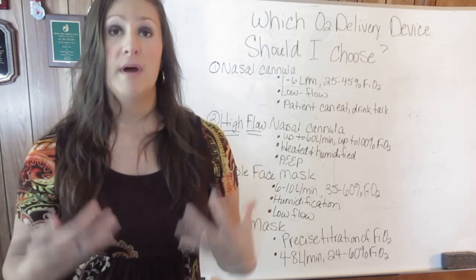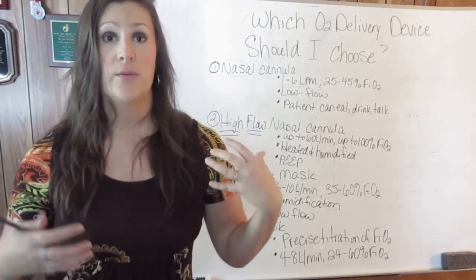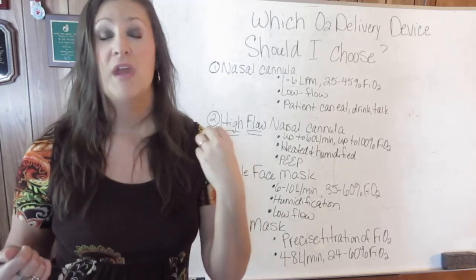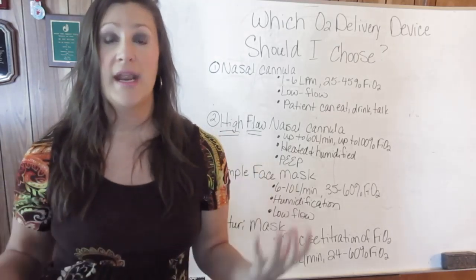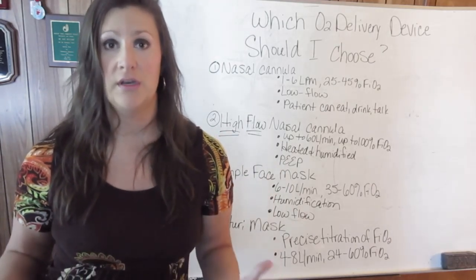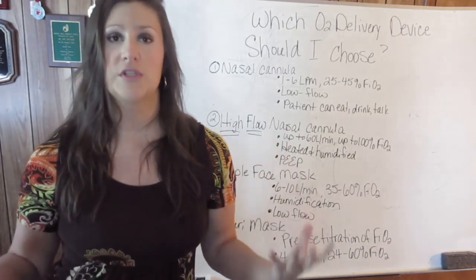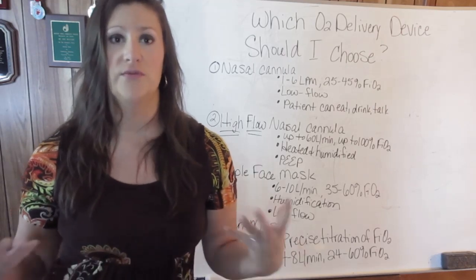These patients must be stable. They must be able to take good, deep breaths for themselves. Nasal cannulas do not help whatsoever with ventilation, meaning removal of CO2. All right, so it's going to be considered a low flow device.